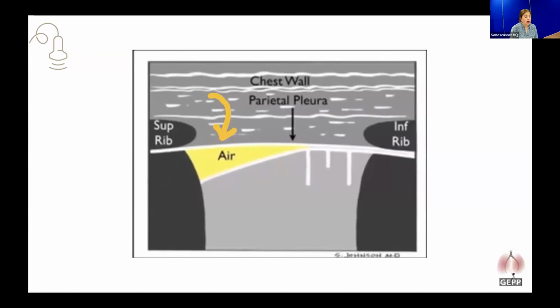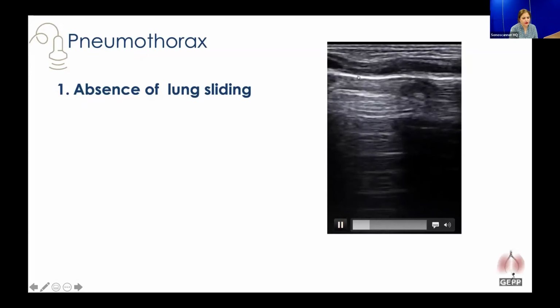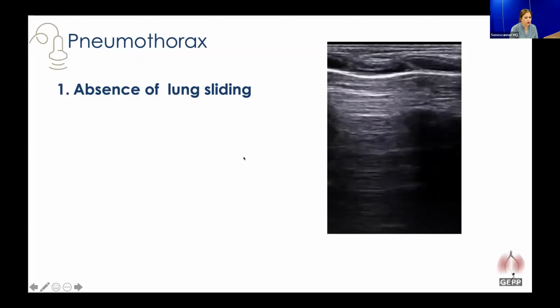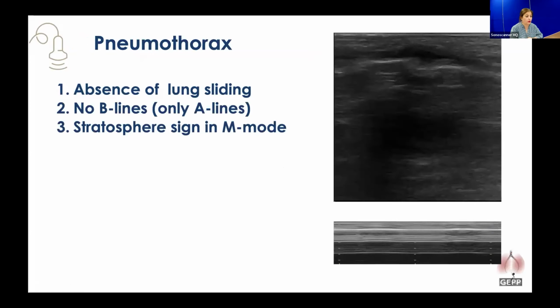So we will not be able to see lung sliding, which makes sense, right? But that means that if we do see lung sliding, let's say you're scanning crashing infants, a child that's not doing well, and your question is, does this baby have pneumothorax? Well, if you see lung sliding, you know for a fact that that baby does not have pneumothorax in this area you're scanning. So the signs of pneumothorax are absent lung sliding. Here's the pleural line. There is no movement of the pleura as shown before. You will have the reverberations of the parietal pleura, which will be the A lines. That means that if you see a B line, which comes from the visceral pleura, this cannot be pneumothorax. That also rules out pneumothorax.